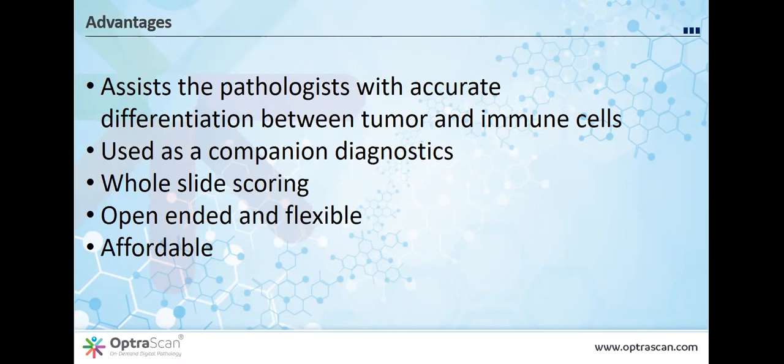So we have one more question for you, Dr. Taylor. Yes. Even when a pathologist is experienced with PD-L1 testing, how to distinguish every tumor cell from immune cell on H&E? Well, the answer is we really can't.